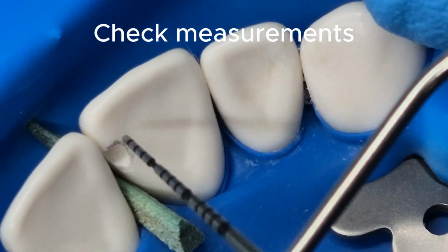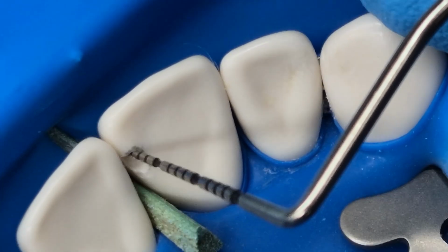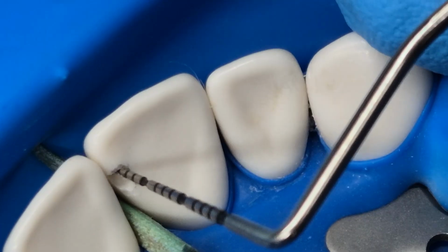From time to time, you can stop and take measurements: depth, width, the length of the cavity, and so on.